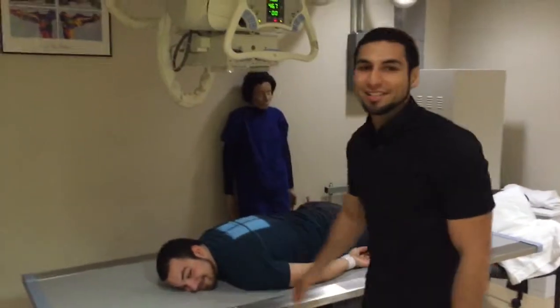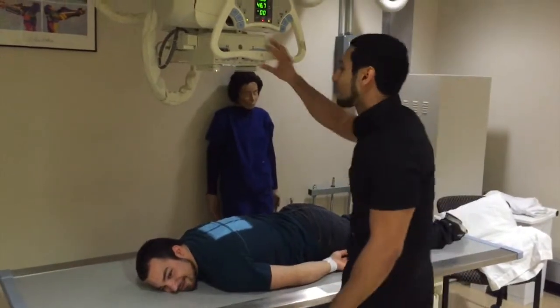It's called the Waters projection. It's about the facial bones.